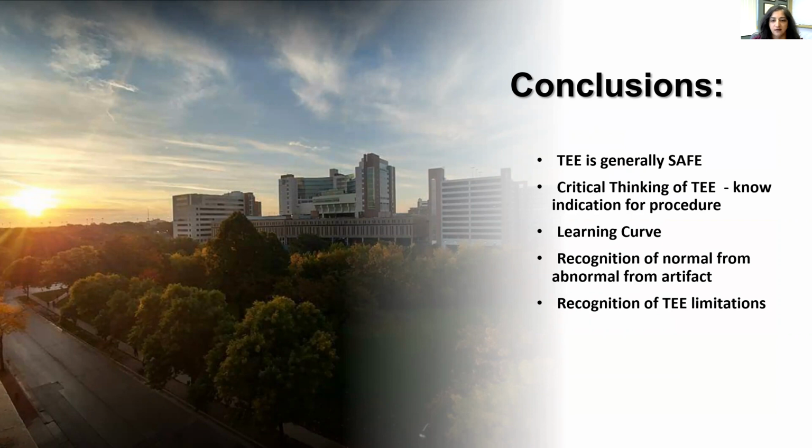And then recognition of the TEE limitations is also something that's very, very testable.